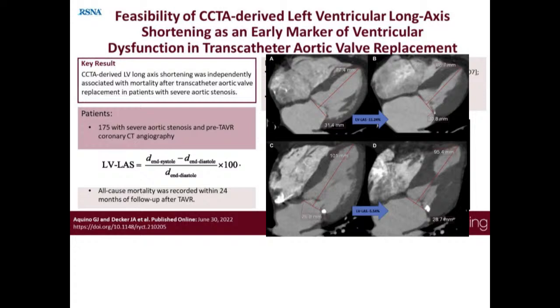Reproducibility was very good at inter-observer. So this could be something interesting, and this paper actually showed that this parameter predicted mortality in patients who were supposed to undergo TAVR for severe AS and having medical therapy only. It was a predictive outcome even independent of LVEF. Something of interest for research.